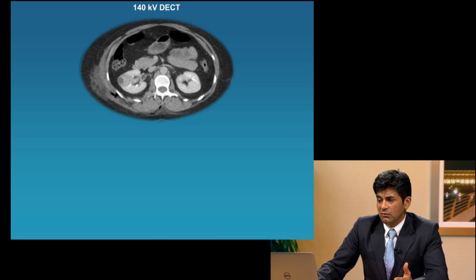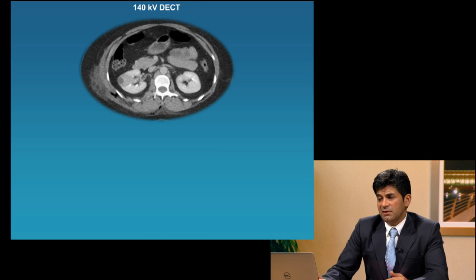When she came to our hospital, we scanned her using dual energy CT, and here we noticed a lot of changes in the soft tissues on the right side, the rib fractures, but also we discovered an abnormality in her right kidney. And one of the questions is always whether this is a trauma to the kidney, and that is an area of bleed inside the kidney.